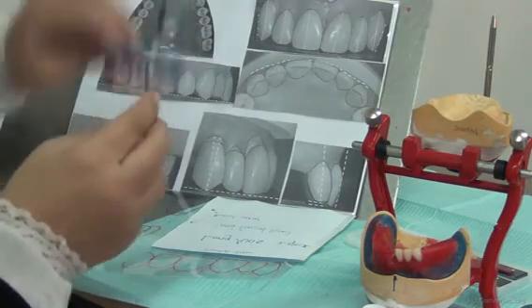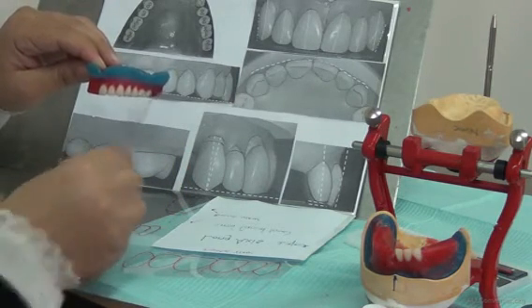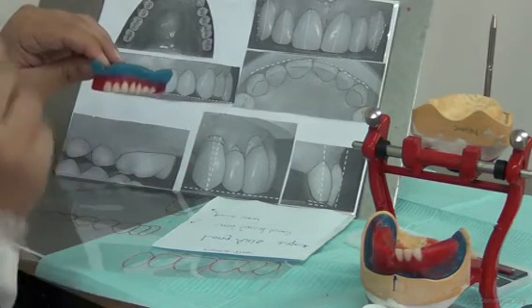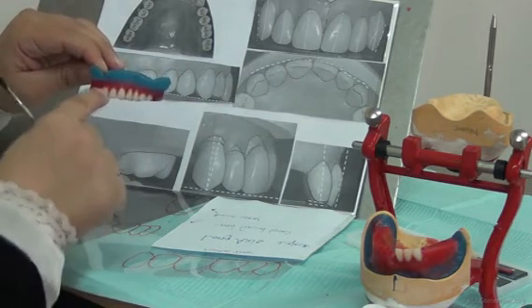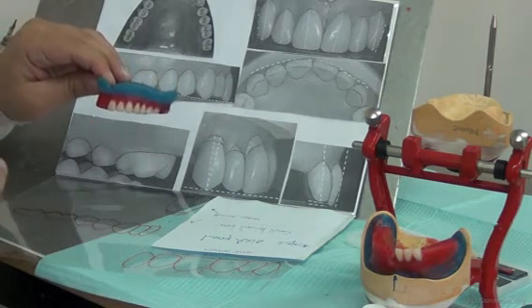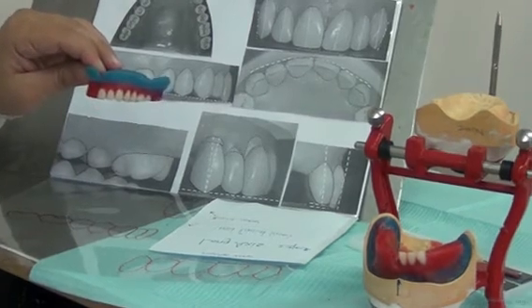Then we put that work on the glass slab, and then we compare the contacts, which tooth is in contact and which is not. Then we judge your angulation of the teeth, and then judge the root position of the teeth. And once you have all that finalized, you will have your setting correct. Thank you.